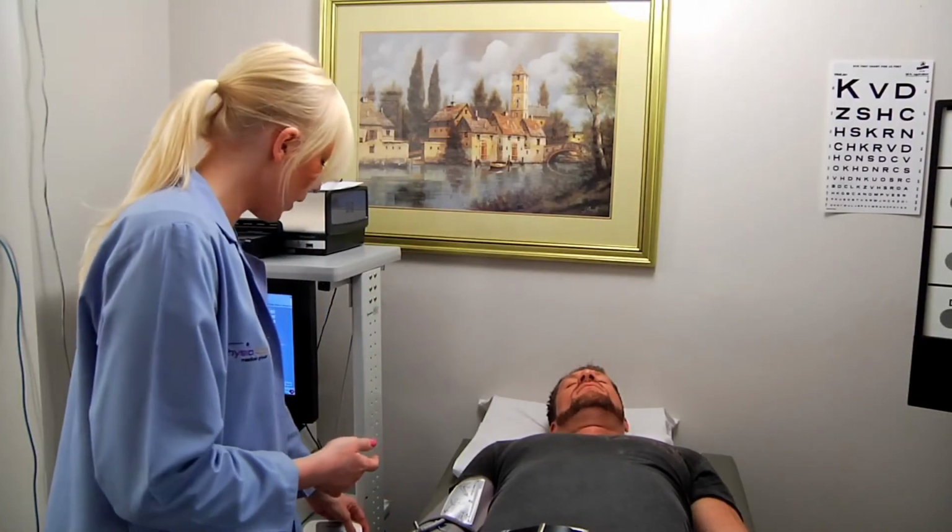It's been 10 minutes, the patient's rested. I enter the room, the lights are still off, and I come right over to the patient and tell them to continue to relax. I'm just going to start the blood pressure cuff. So I'll do that right now.